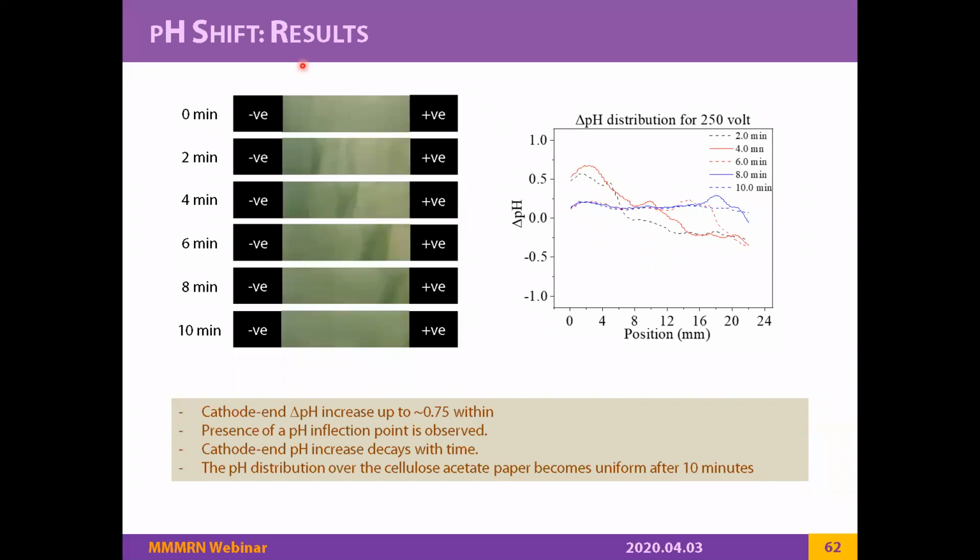So this is one of the results that you can look into. You see the pH on the paper at the beginning of the test, how it changes, and what happens at the end of the test. You can clearly see the pH shift or pH change on this axis with time. It starts flat, then we have a large pH change, and then it becomes stable again. We ran this test for different runtimes, different buffers, and different test parameters, like different voltages as well. So this is a sample of the test data that we're looking at here.